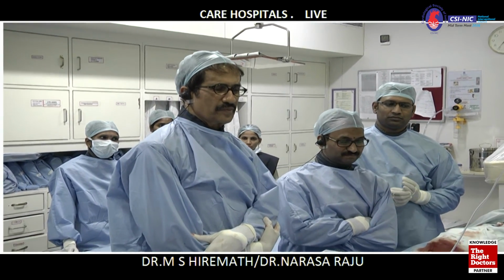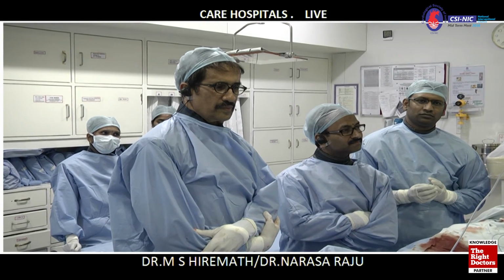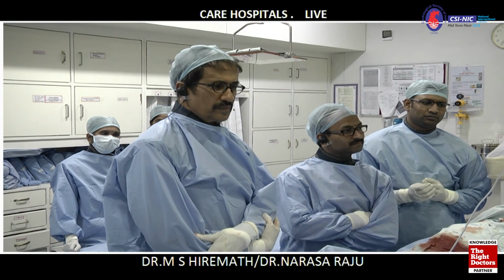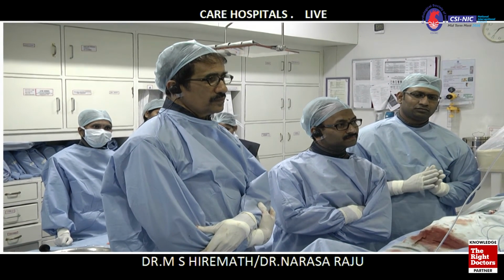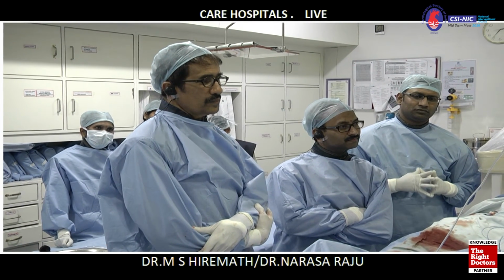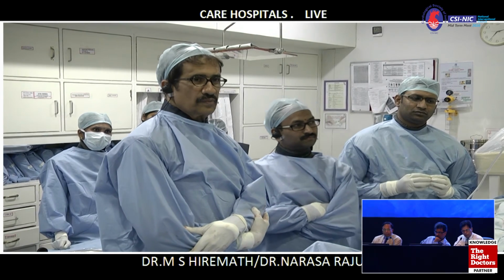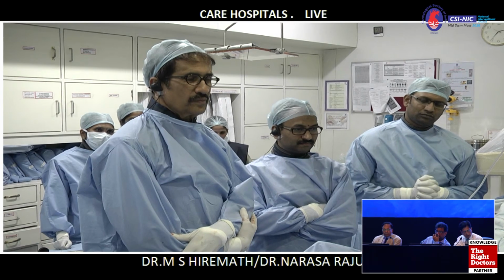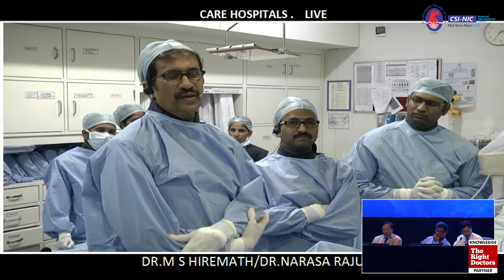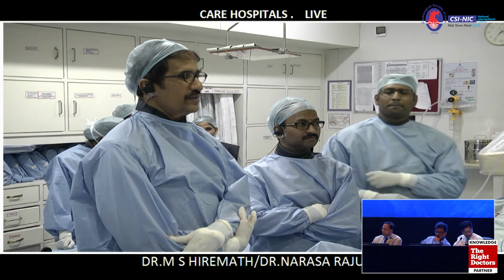Just I have a query. Our centers always run short of hardware. You said that if you do not have more than 4 balloons, then we'll put another wire and put another balloon and dilate. Does it cause an elliptical shape of the stent? What is your experience? We don't. Never used it.